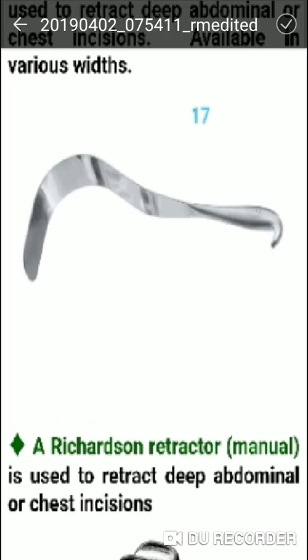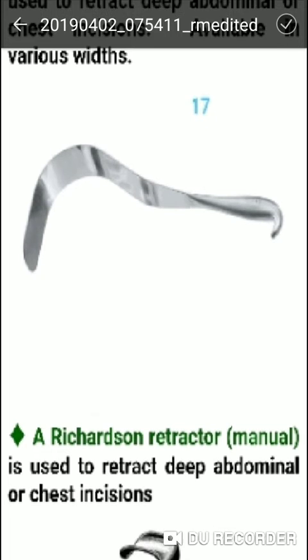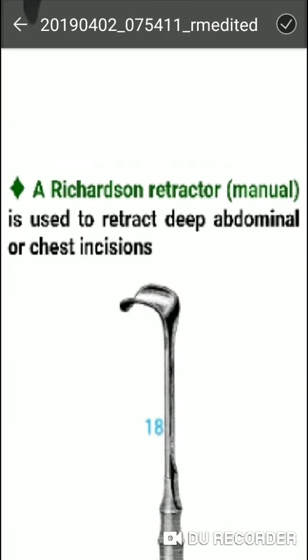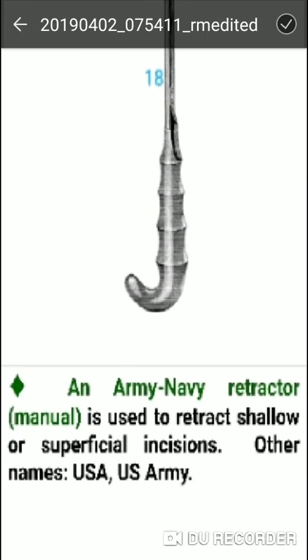The Richardson retractor is used to retract deep abdominal and chest incisions. Next is the Army-Navy retractor, a manual retractor used to retract shallow or superficial incisions. Other names include the U.S. Army retractor.